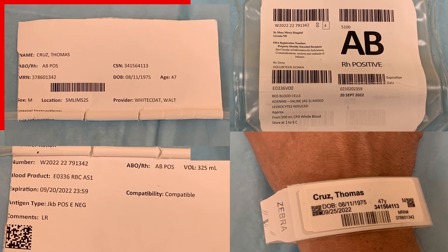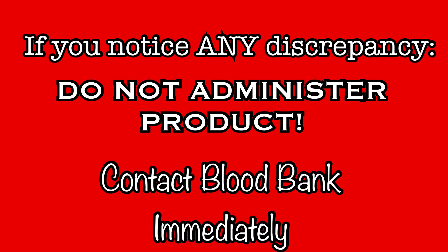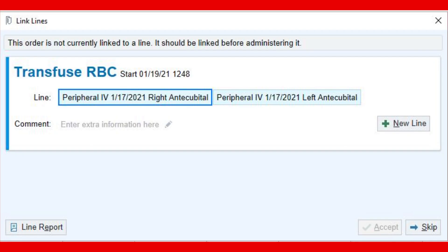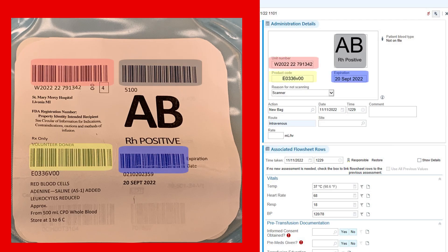If all information matches, the product is safe to administer. If there are any discrepancies, do not administer this product — contact blood bank immediately. If the verification was successful, log into EPIC to finish the process. Go to the blood flow sheet and click on Begin Blood Transfusion. A prompt appears to link the product to a specific IV — choose the line that will be used for this transfusion. Then scan the unit number, product code, blood type, and expiration date barcodes.